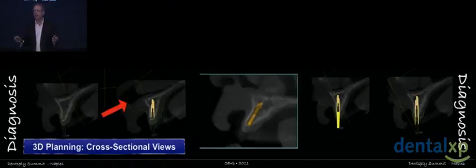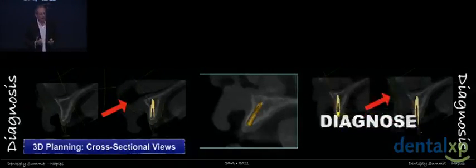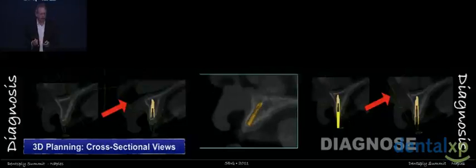going to come out through the body of the tooth. And once we have that information, it allows us all of the diagnostic images that we really need until we get to the next phase. This diagnostic tool is extremely powerful.